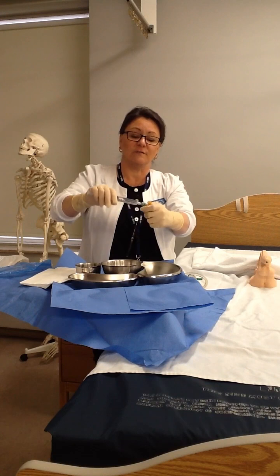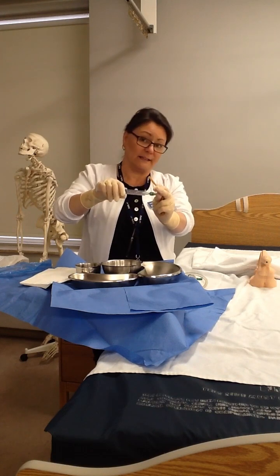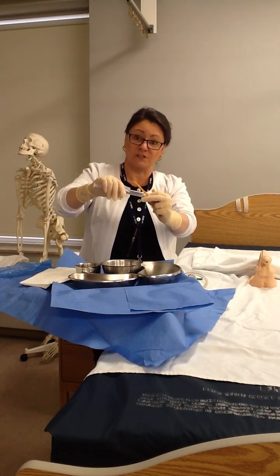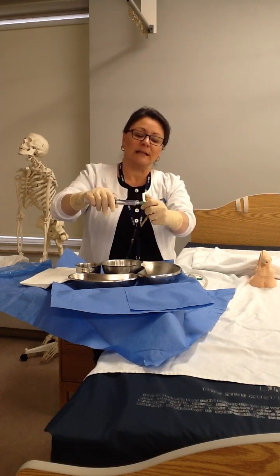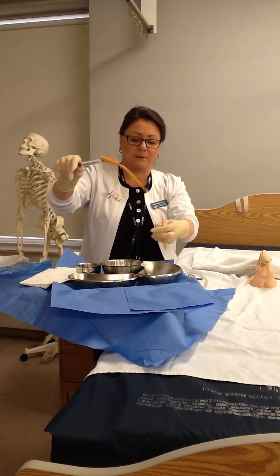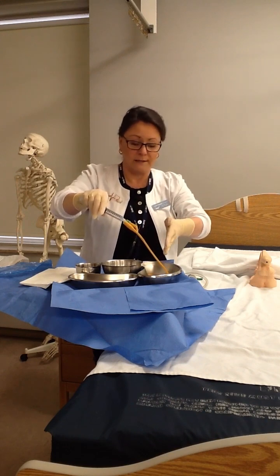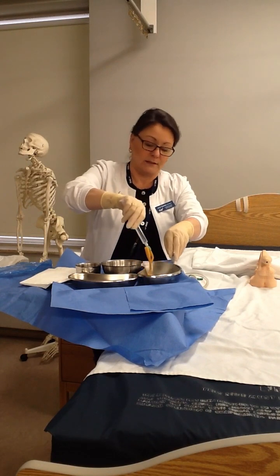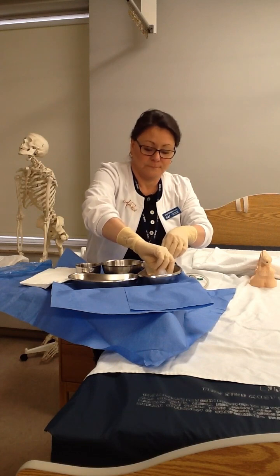That syringe is going to fill the balloon at the end of this catheter when we're all done inserting it all the way. And so then we have to remove this syringe when we're done inflating the balloon. So we'll get to that in a second. So next I'm going to let it unravel. I'm just going to hang on tight to it, and I'm going to let it fall into the large emesis basin, the one to the far left, the biggest one.